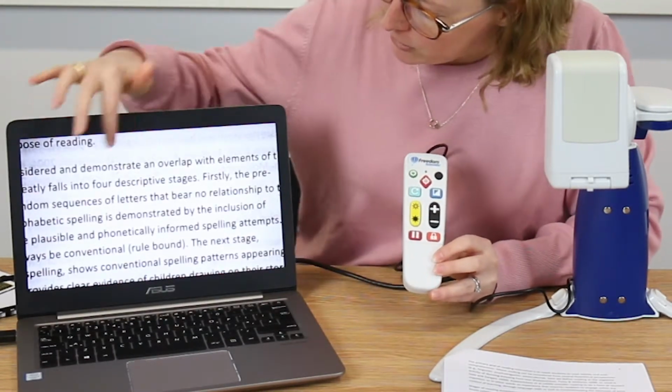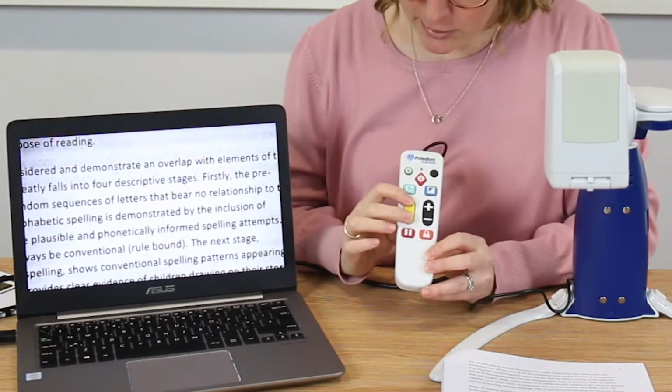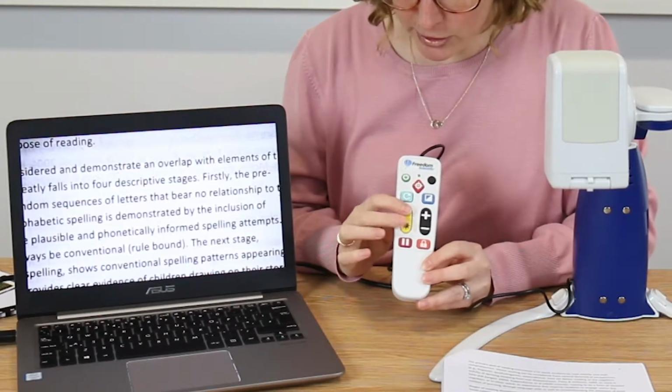So I can see that we've got, as I mentioned, some writing that's almost ghosting a little bit around here. So in order to adjust that, I'll show you what the two ends do.